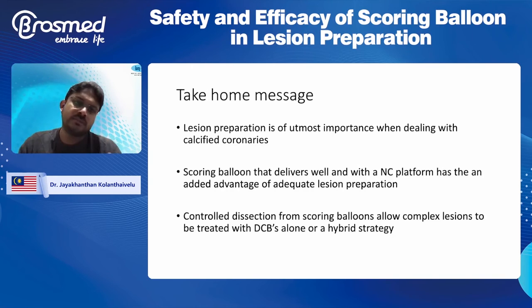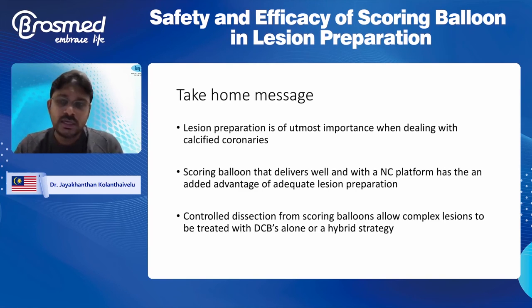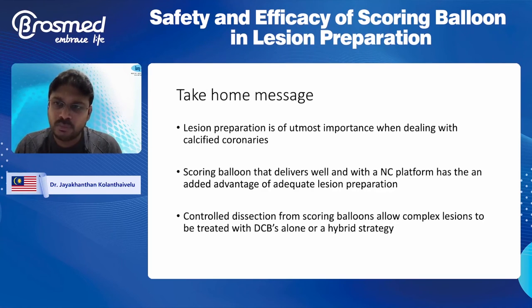That's about the cases that I want to share. So the three cases that I shared show, in my opinion, how I use NC pre-dilatation balloons. I think especially when you're dealing with calcified lesions, I think the other speakers will go through this as well. Lesion preparation is the most important. You never want to deliver a stent when you're not happy with the lesion preparation. You want to make sure the stent will open adequately. You don't want an underexpanded stent which you cannot expand adequately, and you run into trouble later on. So I think the scoring balloons, especially on our NC platform, give us an advantage in this scenario.